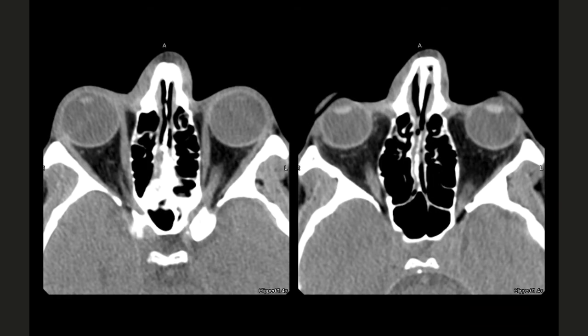So I cannot see the superior and the inferior rectus, but I can see this one nice structure in the posterior mid aspect of the orbit going posteriorly. What is this structure? The neurologists love this. Optic nerve. So the optic nerve goes to the optic canal, which is here. But then this little crevice would be your superior orbital fissure. Different nerves go through different fissures, so when I am looking at it, I am paying attention to those.